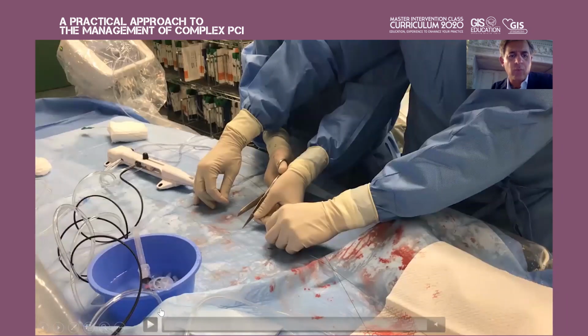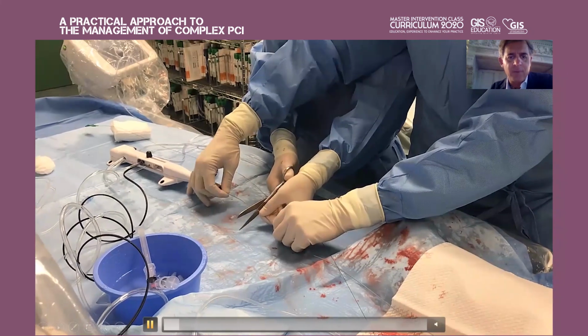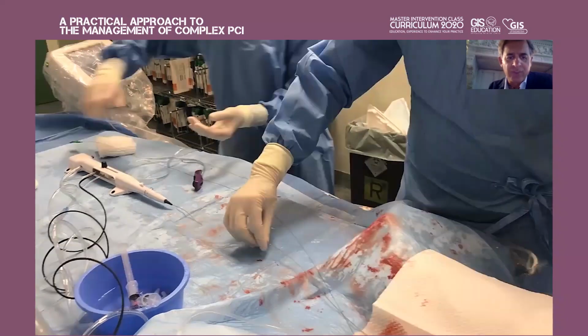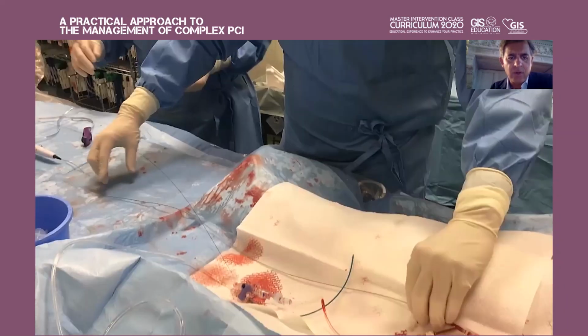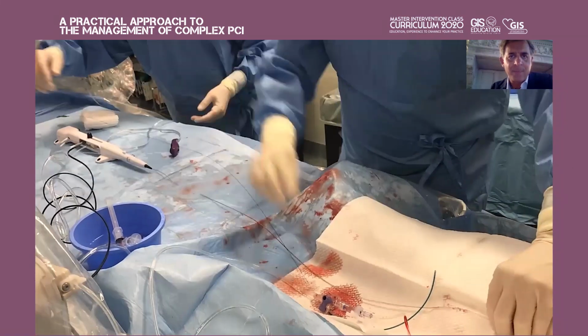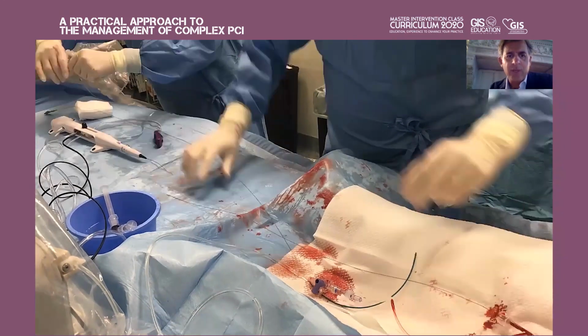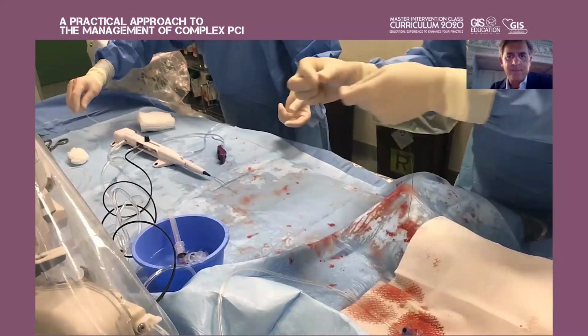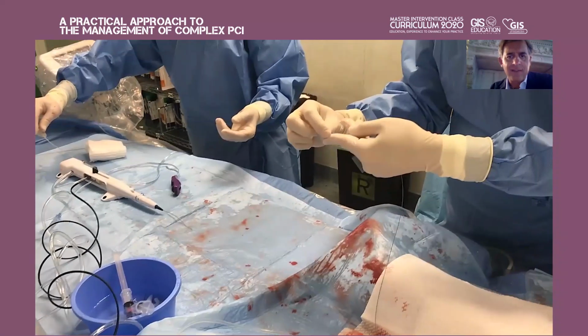In this situation, what can you do? This is a video I performed by myself. You need to cut the system with a scissor. You need to remove the sleeve of your Burr trapped in the artery, and then you can put your guide extension inside.